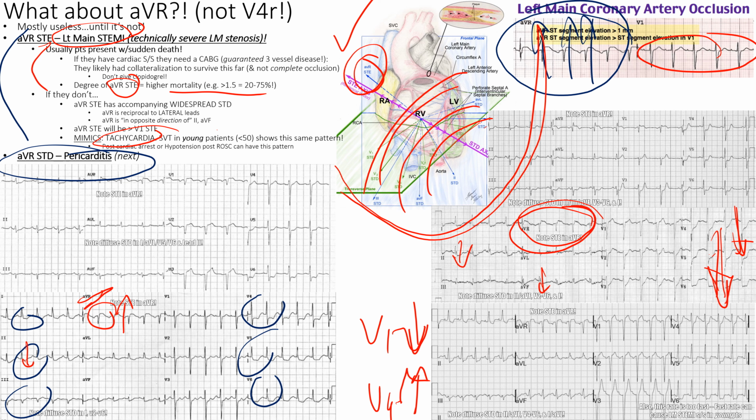Okay, this guy over here, there's definitely some ST depression there. ST depression, even in 2 and AVF. It doesn't make sense. Why would I have ST depression in V6 and lead 2? There's no coronaries that feed both of those, right? Yeah, they could have a right-sided and left-sided, but usually when someone comes to the hospital, it's because one vessel occluded, not all of them, right? So one vessel is down at this time. So the vessel that's down in this situation is a left main, okay, and they need to hurriedly go to the cath lab, right?